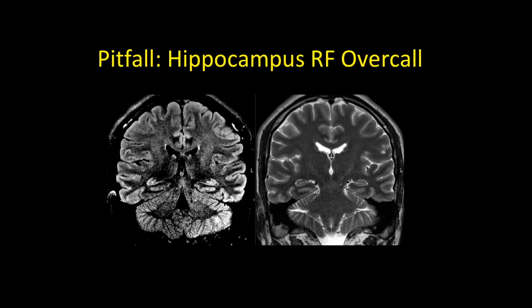A key pitfall: on FLAIR, you might notice the left hippocampus appears brighter than the right and suspect mesial temporal sclerosis. But if you step back and see that the entire temporal lobe and cerebellum on that side are brighter than the contralateral side, this is actually an artifact from RF inhomogeneity at 3 Tesla. If the entire lower left side of the brain is brighter, that's likely an RF overcall artifact. Confirm by checking T2 — there should be no signal abnormality or architectural distortion in the left hippocampus.